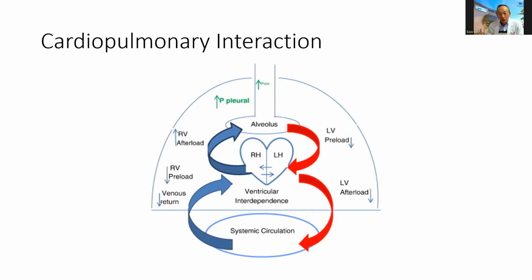And if I have a situation whereby you have a myocarditis and the patient has a very weak ventricle, the contractility is very poor, then you want to make sure you help the left ventricle a bit more. So you want a pressure that is a bit higher on the lungs, maybe a PEEP of 8 to 10, and then oxygen that is just adequate to get adequate PaO2, and then keep the patient ventilated for a little longer so that you can dry up the lungs.